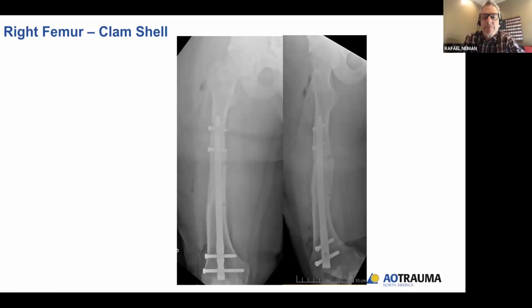Yeah. So you make a great point. You can see she had a pretty significant sagittal plane deformity, which has been mostly corrected, but you see how close the nail is on the anterior cortex. And I think it's probably speaking to that point you made. When you look at the overall correction, they did a nice job.